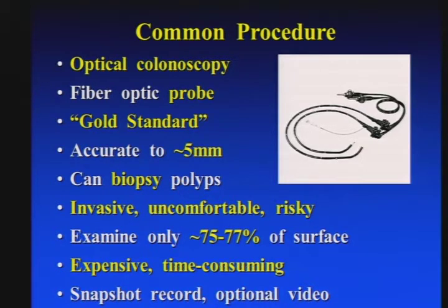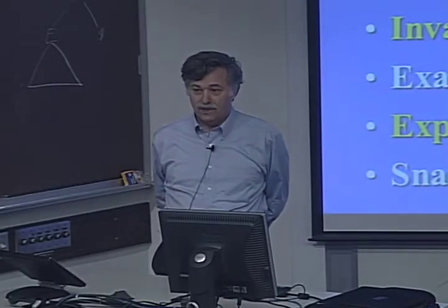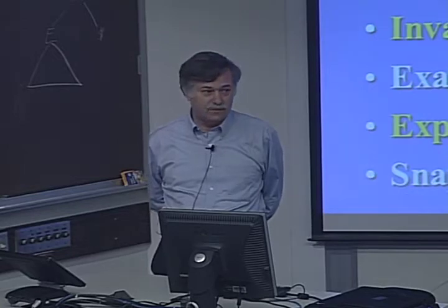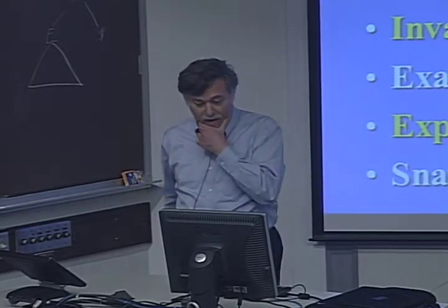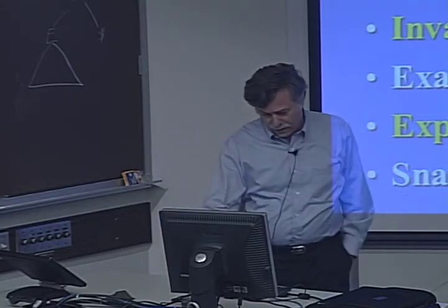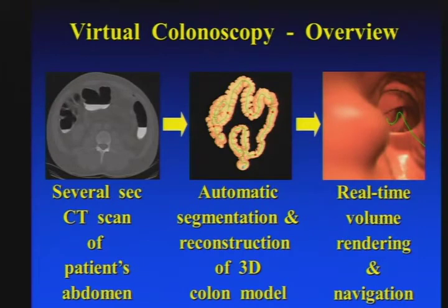it's the gold standard. And the more troubling issue with that is that it examines only 3/4 of the colon surface. 25% is not being examined, and I'll explain to you how we can do it with the alternative procedure. And the alternative is what we call virtual colonoscopy.